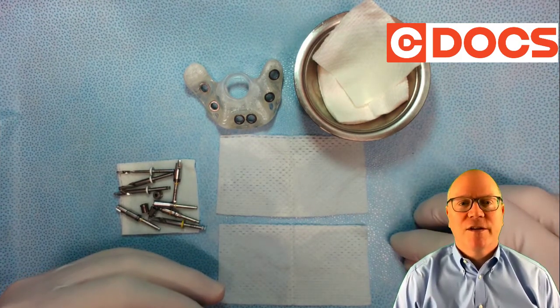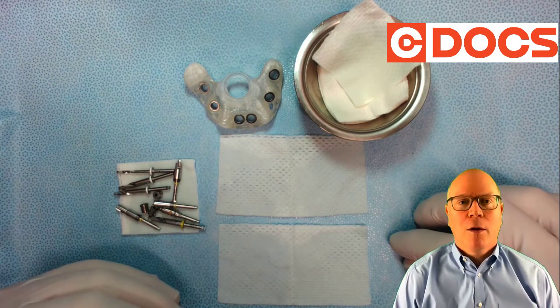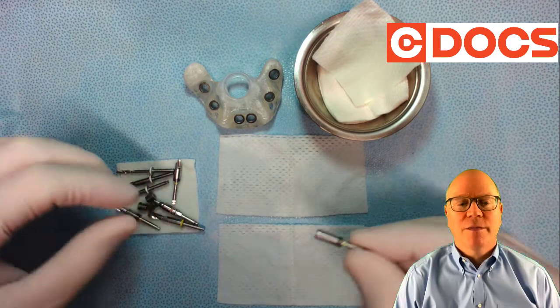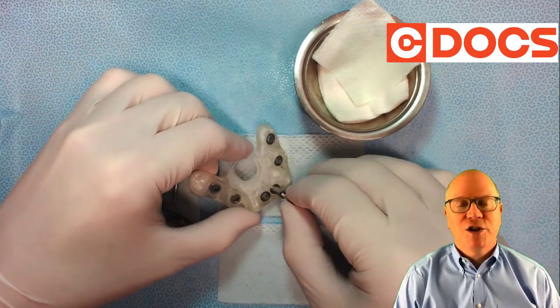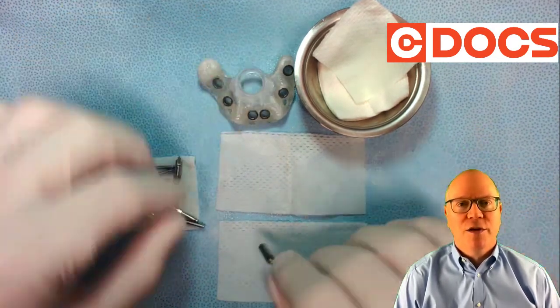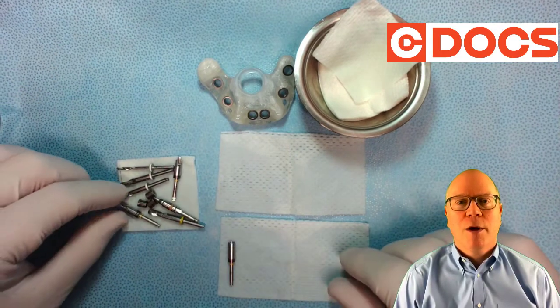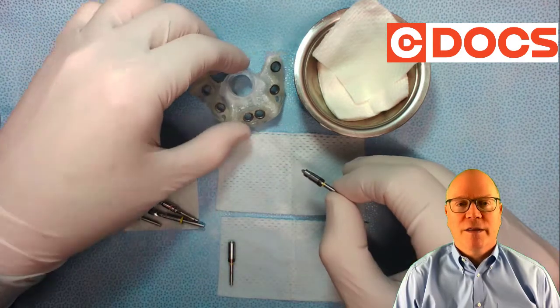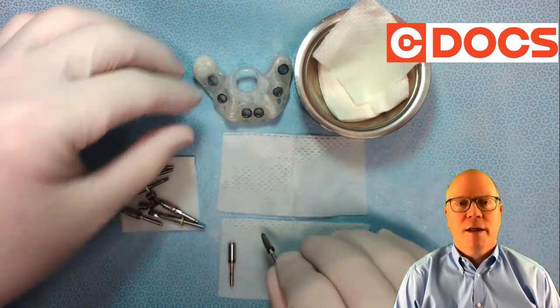So when we're doing this, I have two two-by-twos — one for the ones I'm going to line up, and one for where I'm going to put them after I'm done using them. We're going to start with the tissue punch, and I always check it with the guide just to be 100% sure, and then I'm going to go to the initial drill, check that in the guide, and line that up directly next to the tissue punch.